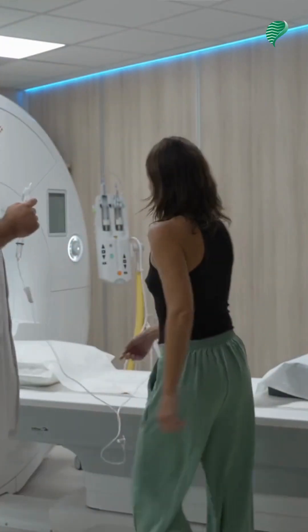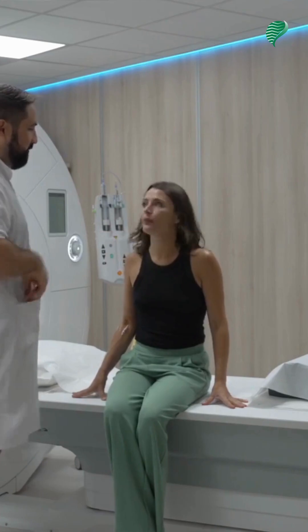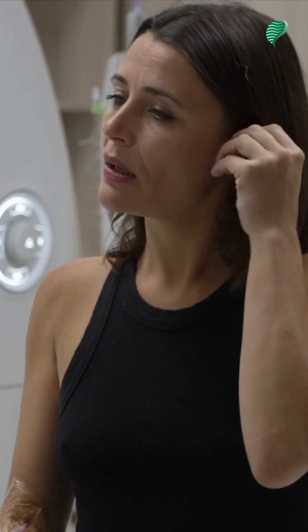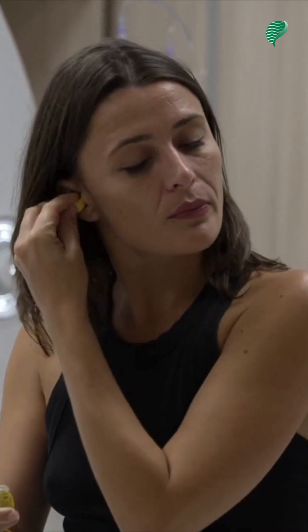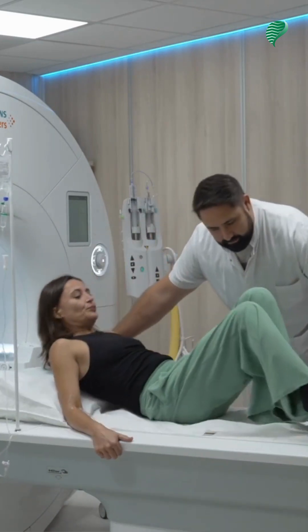The MRI tech will then ask you to lie down in a specific position. Normally, the patient enters the MRI headfirst. He will give you earplugs to protect your ears during the exam because the exam is very noisy, and he will do his best to ensure your comfort, as you will need to stay in this same position without moving for 10-25 minutes.